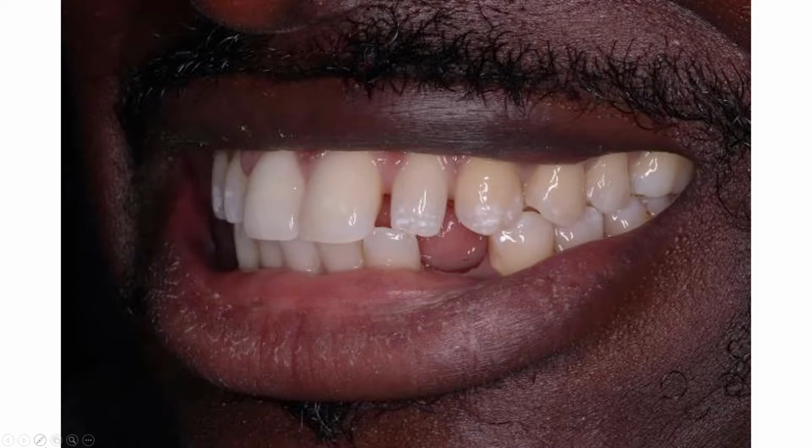Other things to notice is that this patient is a class 3 occlusion, the spacing between the lateral incisor, and also that the lower incisor teeth are very proclined, and this, you remember, made reading the scan in this area a little bit difficult, because when you looked at the scanning view or the OPG view, you weren't able to see the full extent of the entire tooth, crown to root tip, because the tooth was proclined or at an angle.